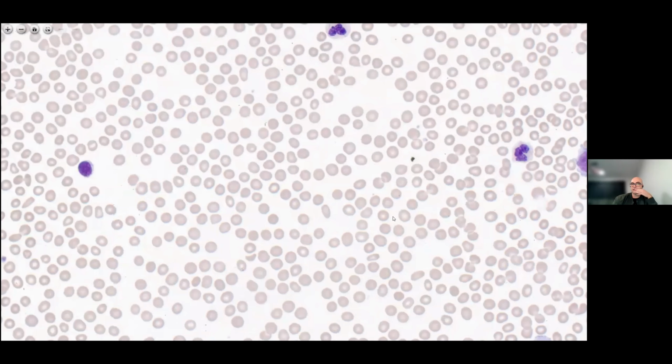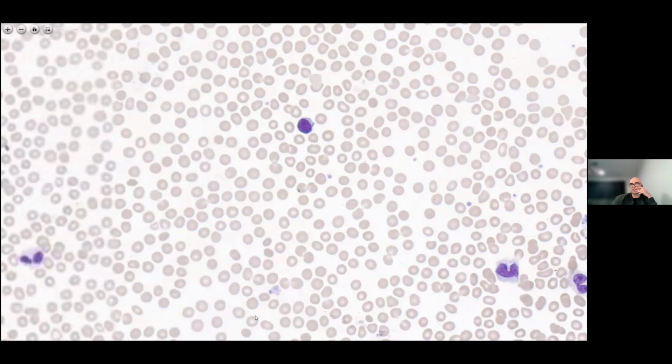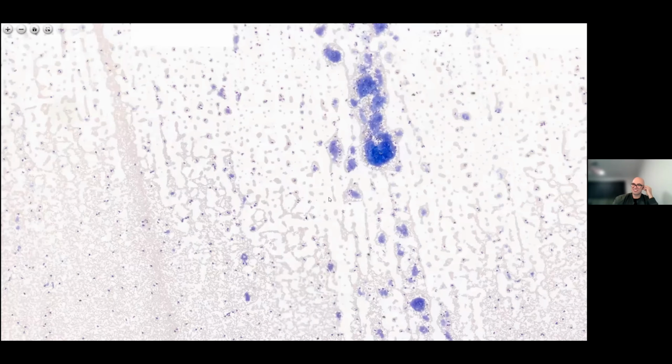So now I guess, Ali, did you want to start discussing troubleshooting, or how we would think about reporting the platelet count for a patient that has platelet clumping in this fashion? This is a really obvious case, quite an extreme one, similar to the previous case. A lot of cases of platelet clumping probably won't look as extreme as this, and you may see the odd clump here and there.